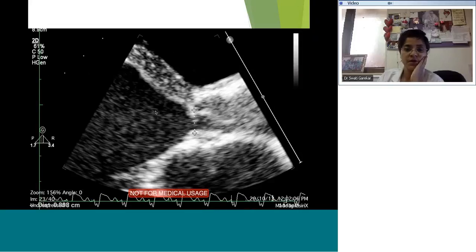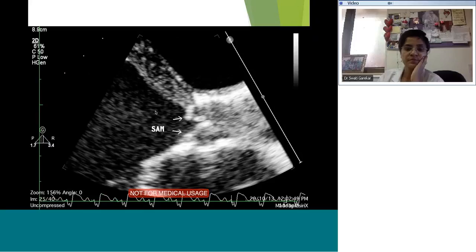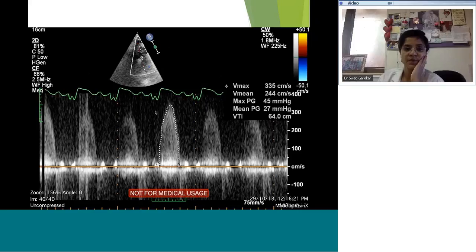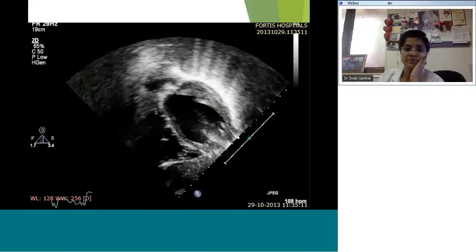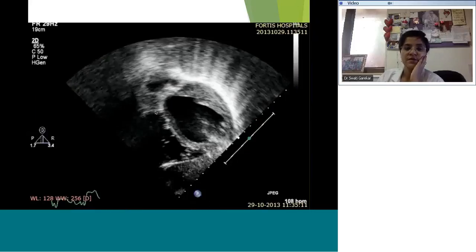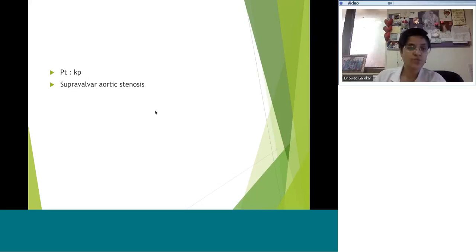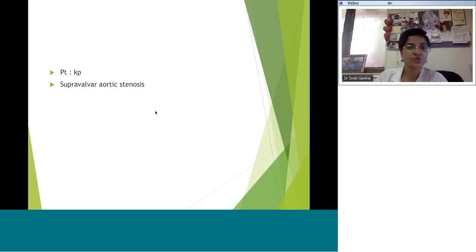We measure out the aortic annulus and also assess how the ascending aorta looks before concluding this case.